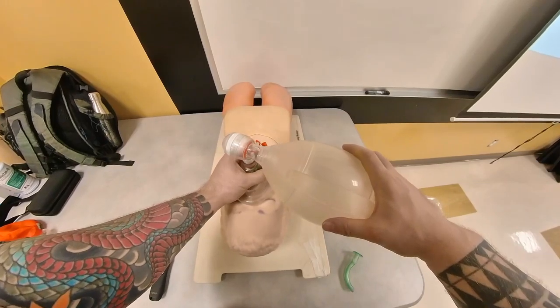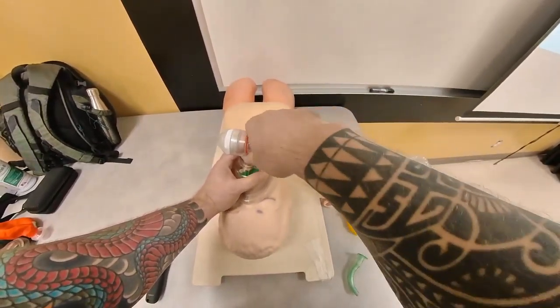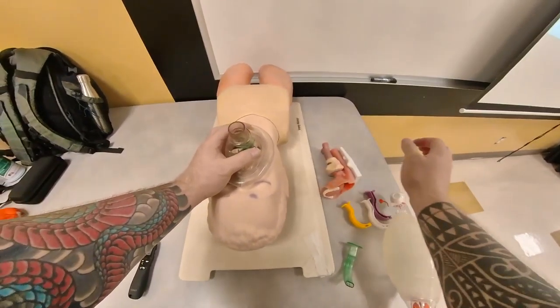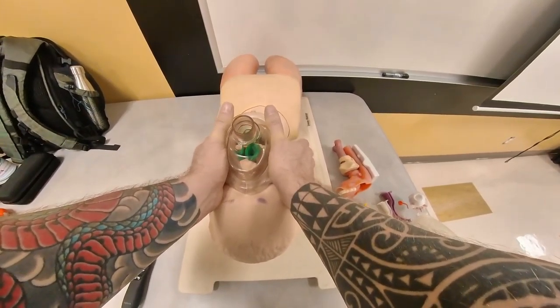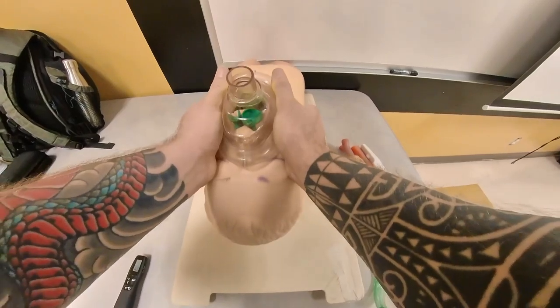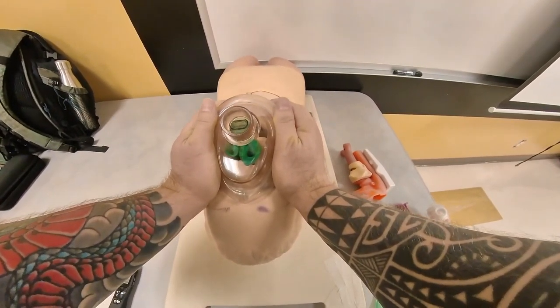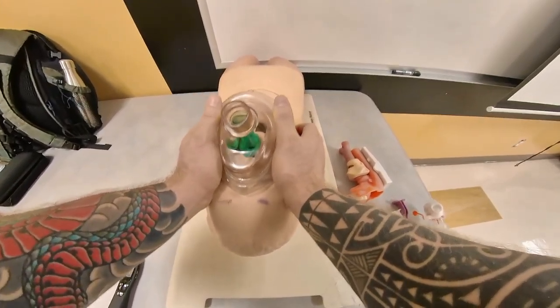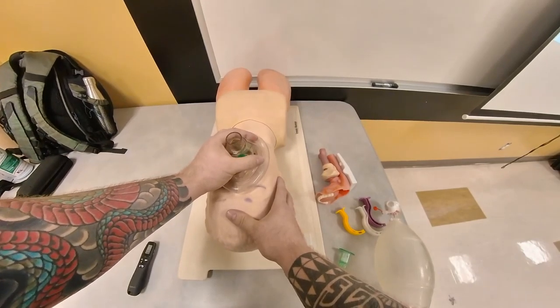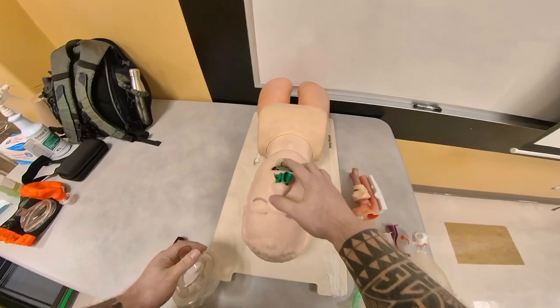This technique — the EC clamp — is a very poor technique. The technique you should be employing is the triple airway maneuver that Peter Safar outlined: lifting the mandible, using your thumbs to keep the mouth from closing, creating a good seal and lifting the head back. You'll notice that my hands are nowhere near the lower mandible, and this technique will not allow me to close the mouth. Using the poor technique with one-hand or two-hand EC clamp is not what you want to do. This is why they employ the OPA.